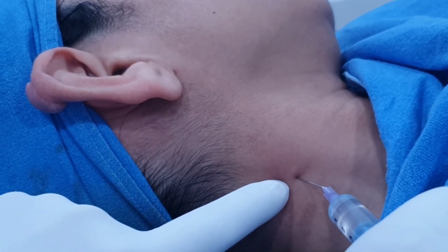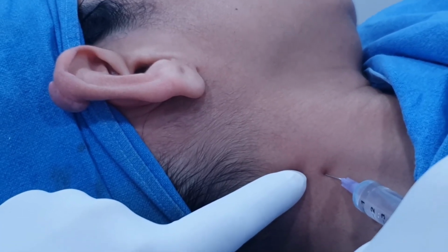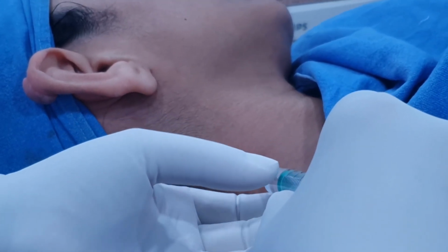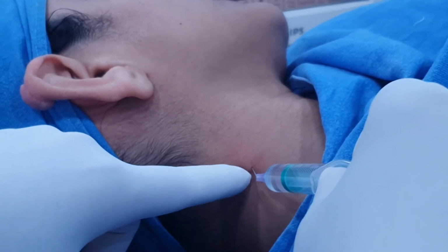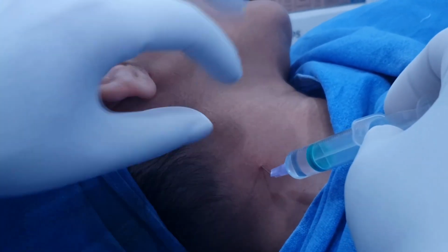Just wait for some time and then advance the needle up along the posterior border of the sternocleidomastoid here. I will pierce the investing layer of cervical fascia and inject 2 ml of the solution just underneath it. This will complete the superficial cervical plexus block.